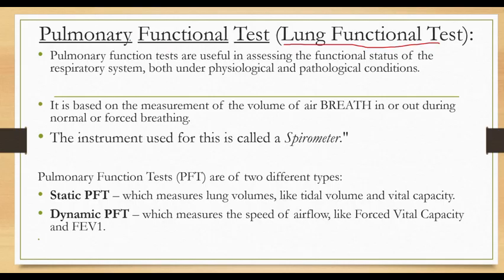Let's see the definition. Pulmonary function tests are useful in assessing the functional status of the respiratory system, both under physiological and pathological conditions. It is based on the measurement of the volume of air breathed in or out during normal or forced breathing. The instrument used for this is called a spirometer.